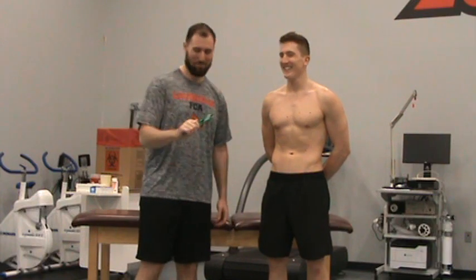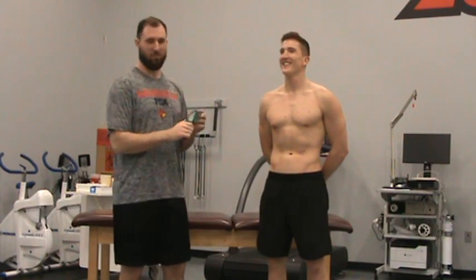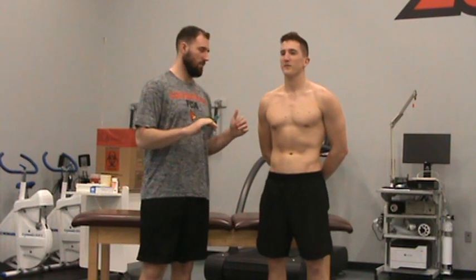Hello. We're going to be going over skin folds. We're just going to be doing the seven site and I'll go over all those. First, just to talk about how you're actually going to get the skin fold.